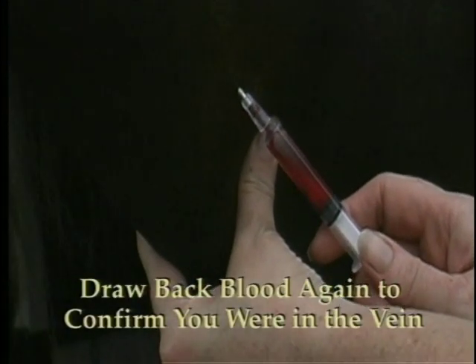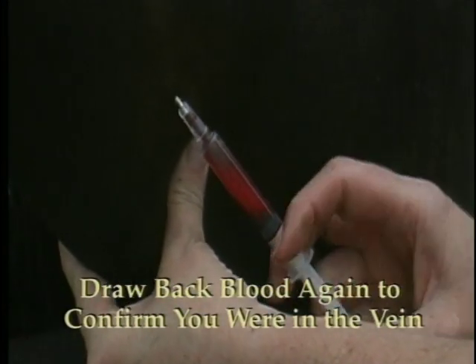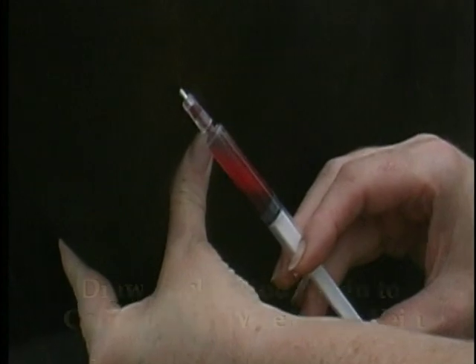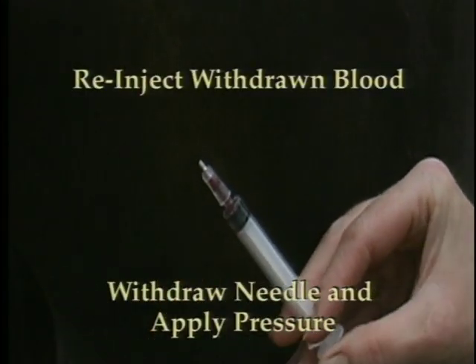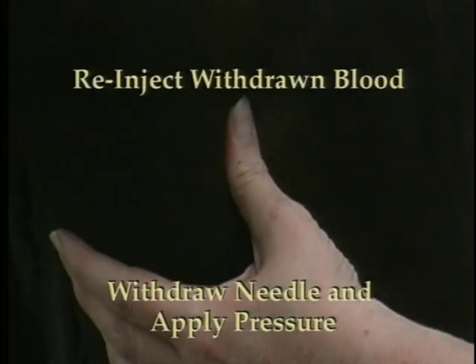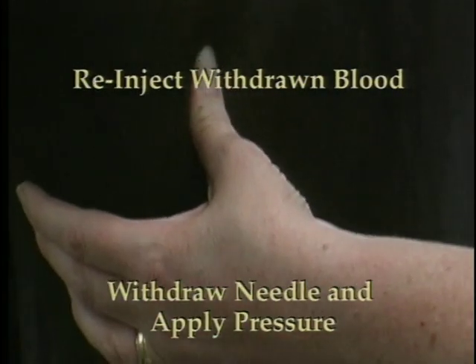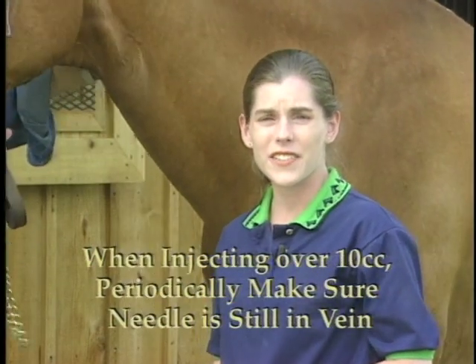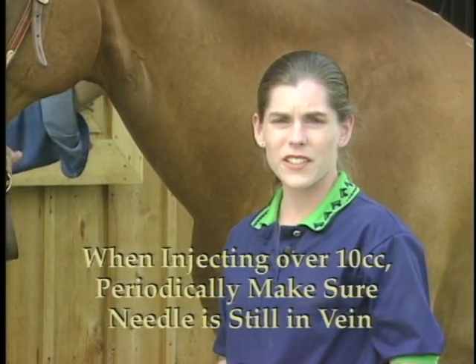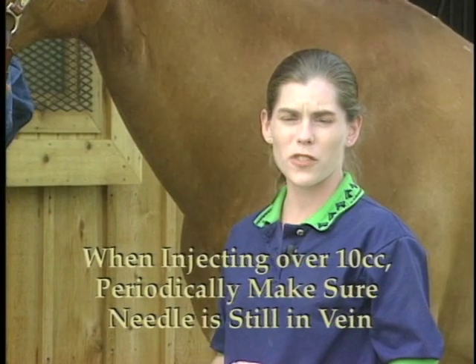At the end of the injection, draw back again to make certain you are still in the vein. Re-inject the withdrawn blood, then withdraw the needle and apply pressure for approximately one minute. When injecting a large volume — say over 10 cc's — periodically check that the needle is still in the vein by withdrawing a small amount of blood.